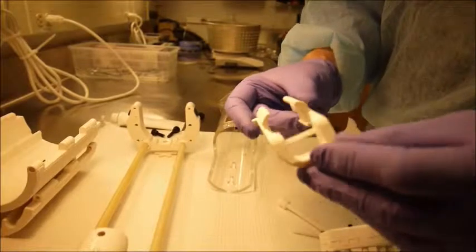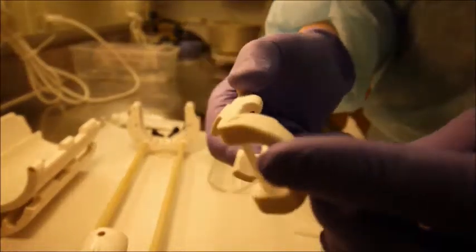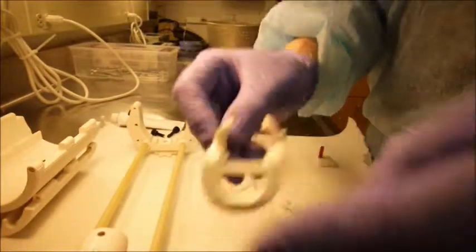Shown is a RAT head strap. You can see a horizontal bar for holding the front incisors. On the inside of the head strap are small circular cushions to minimize discomfort.